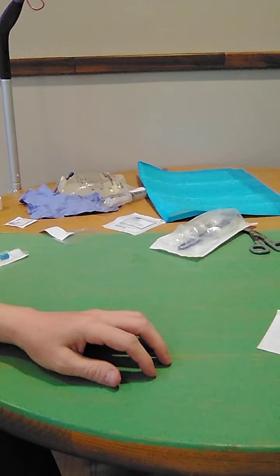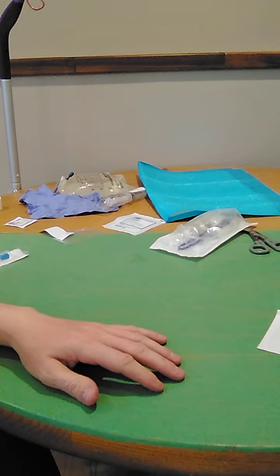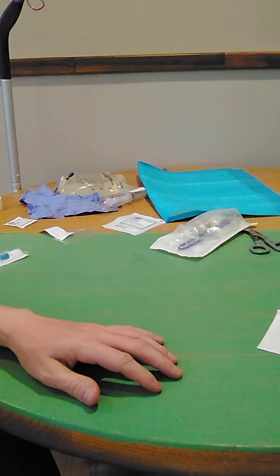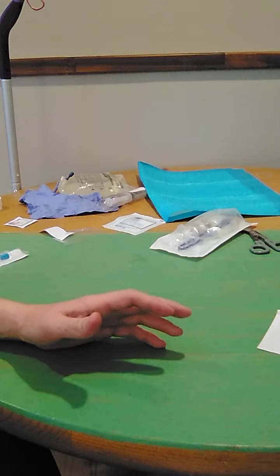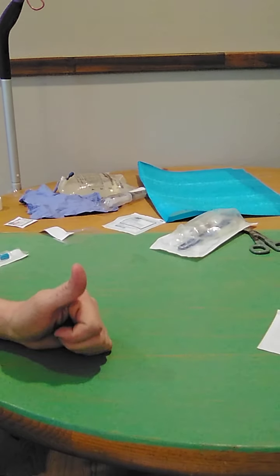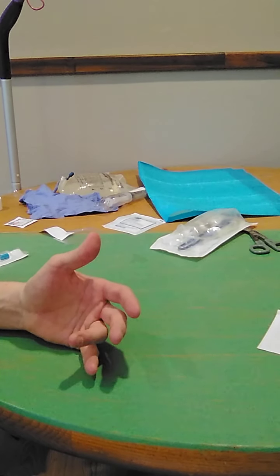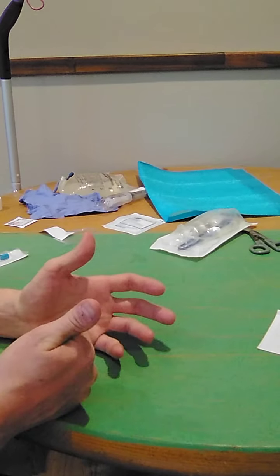This is my return demonstration for the assignment of IV initiation of a peripheral intravenous infusion. So, firstly, we're going to check our 6 rights of patient medication administration, which are the correct documentation, the correct route, correct patient, correct time, correct medication, and the correct dose.